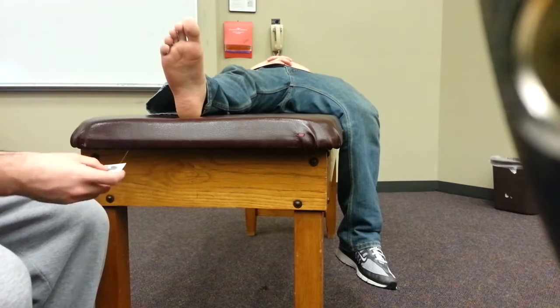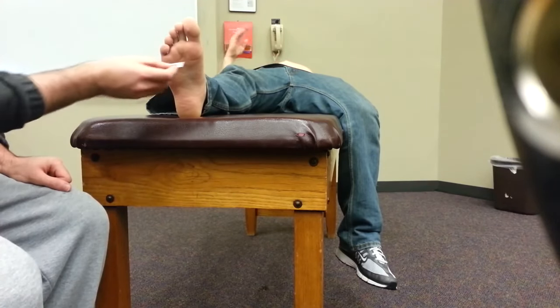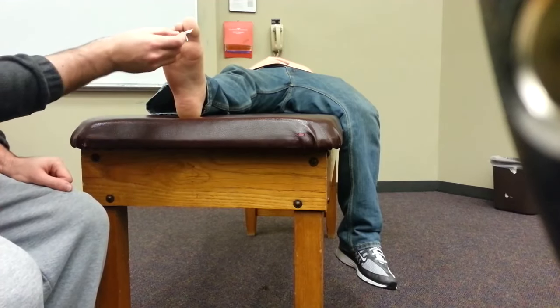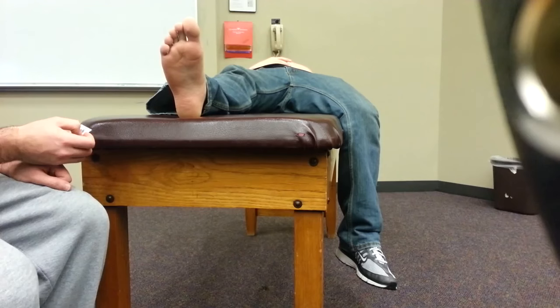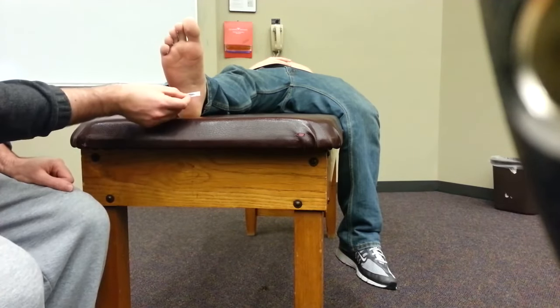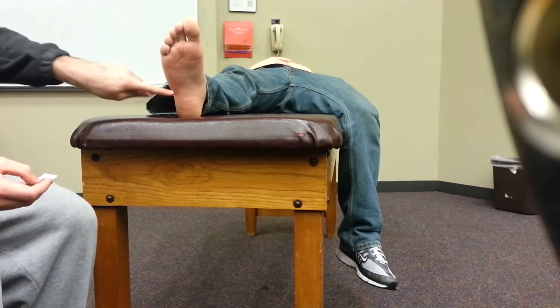Just indicate when you feel something. That was all nine spots on the bottom — here, here, here.